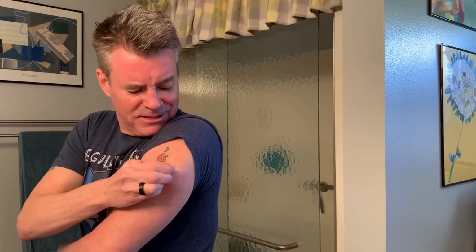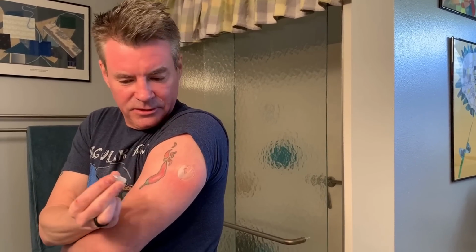In terms of removal, once you get to day 13, you'll start getting little alerts on your phone telling you that the sensor is going to run out, and eventually it gets down to the final hour and it tells you you've got an hour to replace your sensor. Removing it is as simple as peeling off that Levels sticker and then just peeling off the sensor.